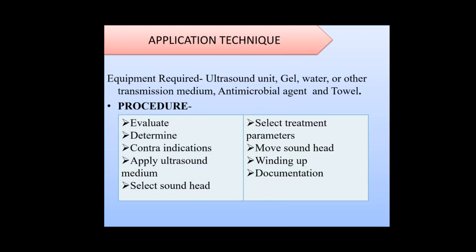Then the second stage. Second, you have to determine whether ultrasound is the most appropriate intervention for the condition, whether it will produce a beneficial effect on the condition or not. You should know the effect of the ultrasound on whatever conditions the patient will come up with.